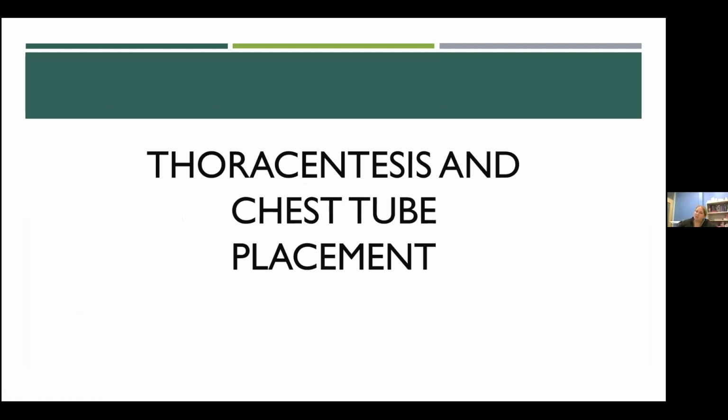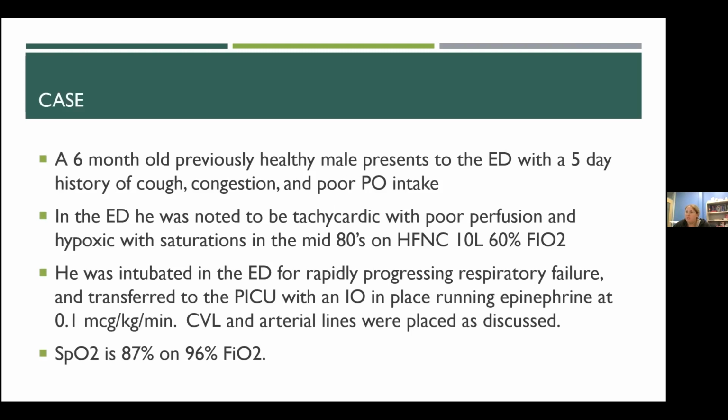All right. So moving away from vessels, some of the same techniques apply. I'm going to go through thoracentesis and chest tube placement. This is one where I think there's a lot of variability of whether people use ultrasound or not, but hopefully we'll go through some data that will show you that there is support for it and that there are some pretty good reasons to try to invoke ultrasound in your chest tube placements.